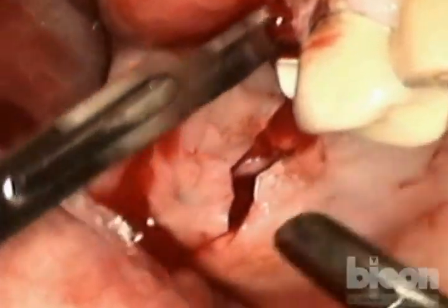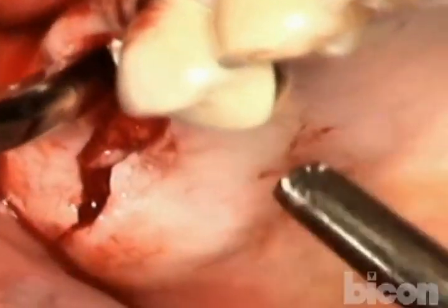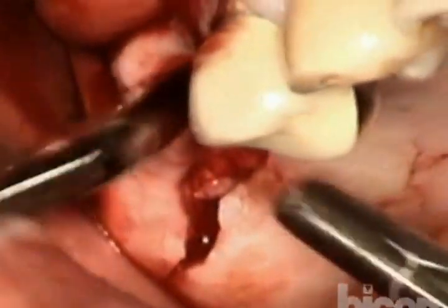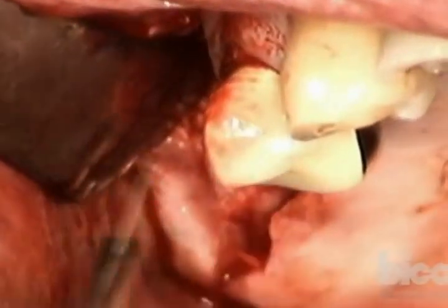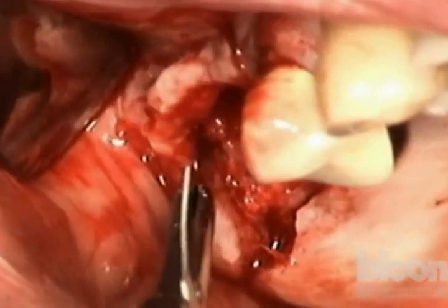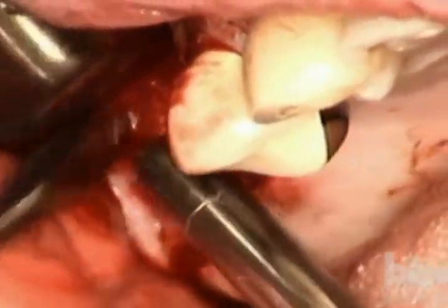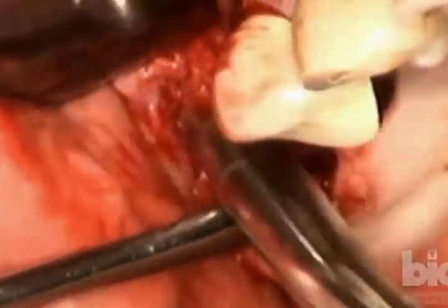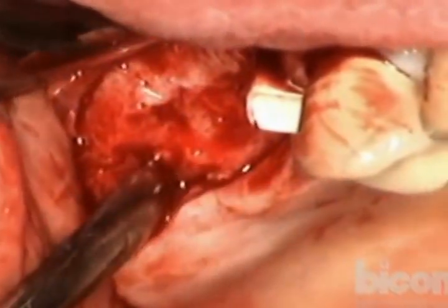Little tag is coming off of the abutment. Okay? All right. Good. Take our time. We need to have full visibility here, and a combination of blunt and sharp dissection. It's very hot in here. Good, all good here. The window will be from about this to right here. The implants will be on both ends of the window.